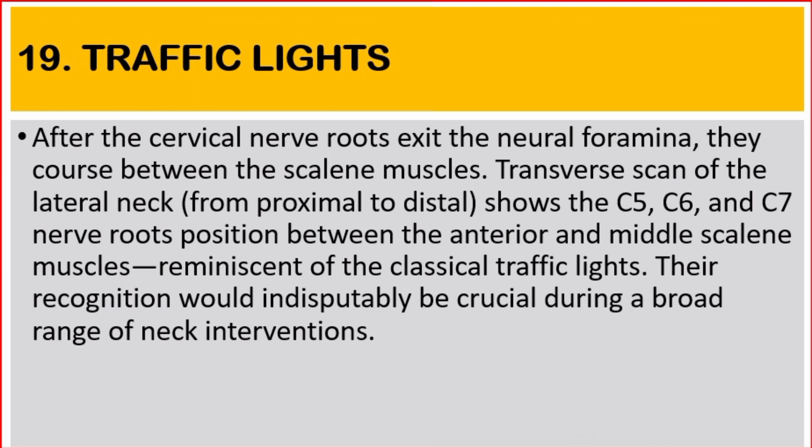Number 19: Traffic Lights. After the cervical nerve roots exit the neural foramina, they course between the scalene muscles. Transverse scan of the lateral neck from proximal to distal shows the C5, C6, and C7 nerve roots positioned between the anterior and middle scalene muscles, similar to classical traffic lights. Their recognition will be helpful during a broad range of neck interventions.